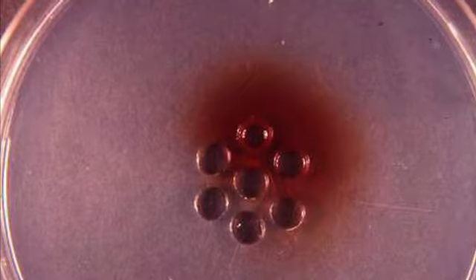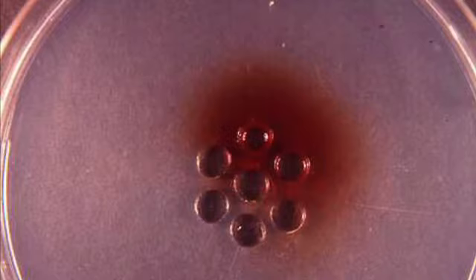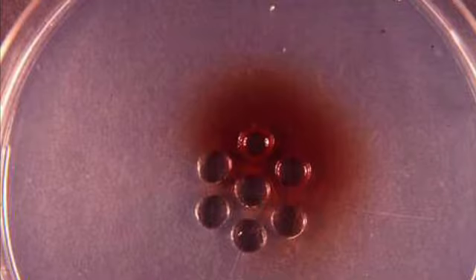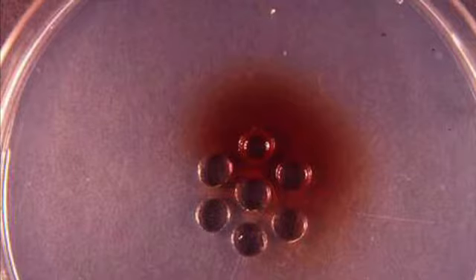It does take overnight, so it's a little bit longer to get your results, but you can test a number of samples. If you've got an unknown, you put the blood from the scene in the middle, and in each of the holes you put a different antiserum. You put anti-deer in one, anti-elk in one, and label them appropriately. And then you come back in, and if it's deer, it'll be between the deer and the anti-deer, and if it's elk, it'll be the elk.